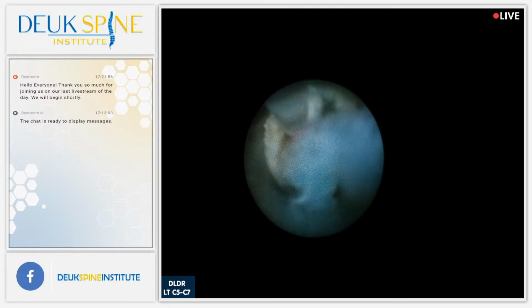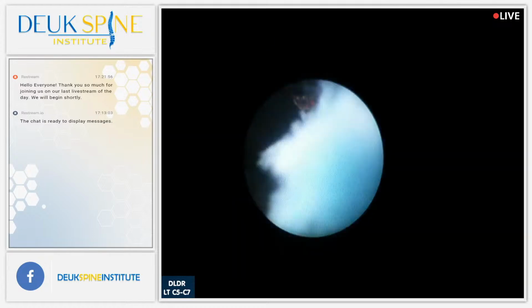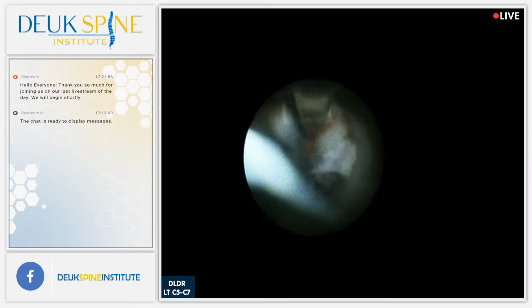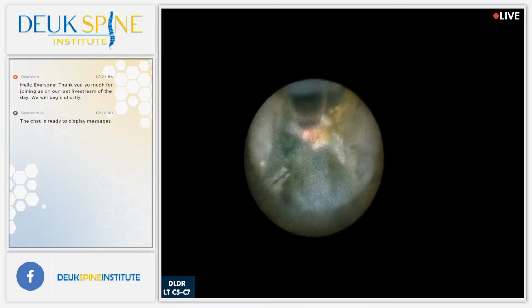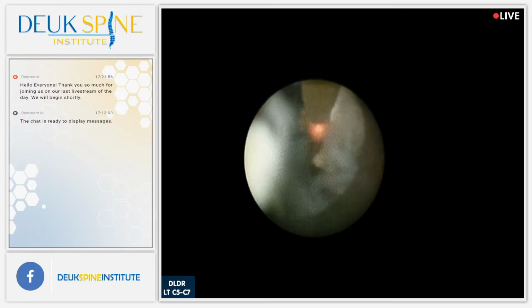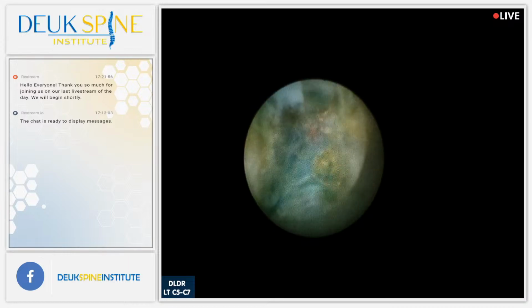In some patients, when the neck anatomy is not so good, where their neck is short and collarbone is high, it becomes really difficult to get the right angle for the surgery. It's impossible to know who I'm going to have trouble with ahead of time. Some people it's quite obvious, but others it's not. To me, she had a nice looking neck. I didn't expect that I would struggle at 6-7.